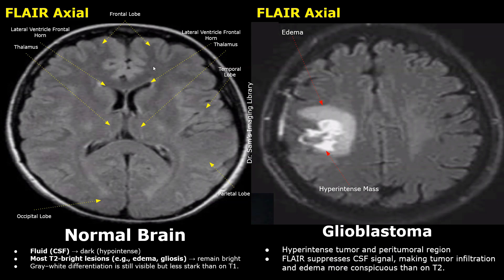This image is of a glioblastoma. The mass still appears hyper-intense in a FLAIR image, and we can see hyper-intense and somewhat more homogeneous edema surrounding the mass. FLAIR suppresses CSF signal, so this makes the tumor and edema more prominent.